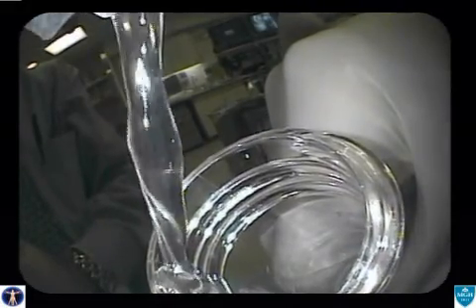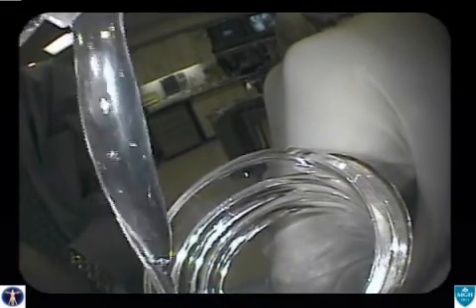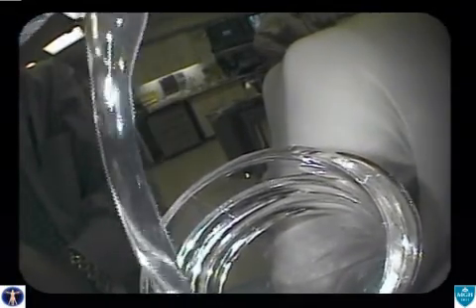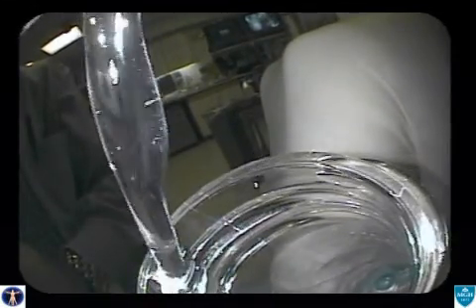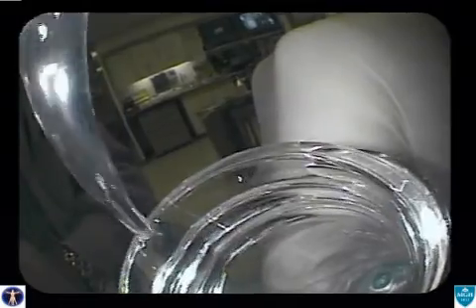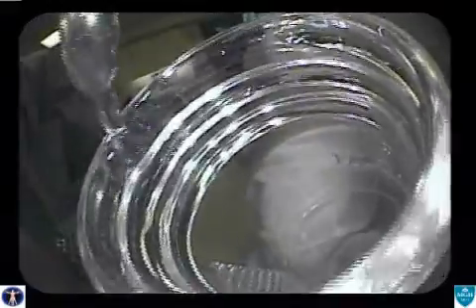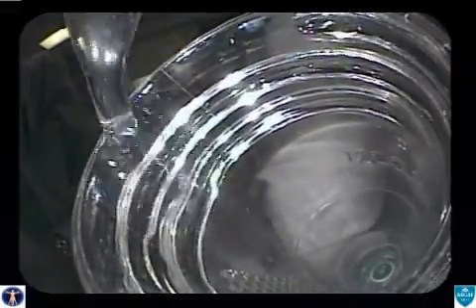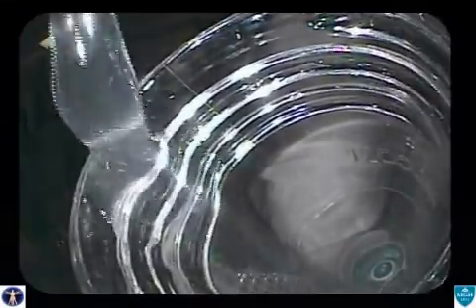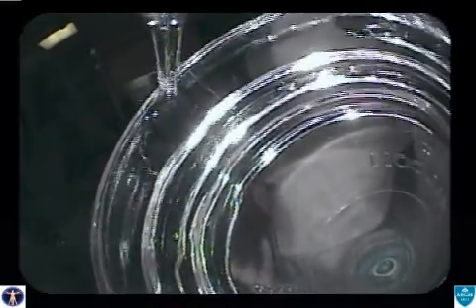Notice the fluid that we have aspirated from this lesion. It is translucent, very viscous, and there's no evidence of blood or infected material. These findings are highly suggestive of a mucinous cystic neoplasm. At times the viscosity of the material makes it difficult to protrude the material out of the 22-gauge needle. Excess material can also be used for additional cytologic examination.